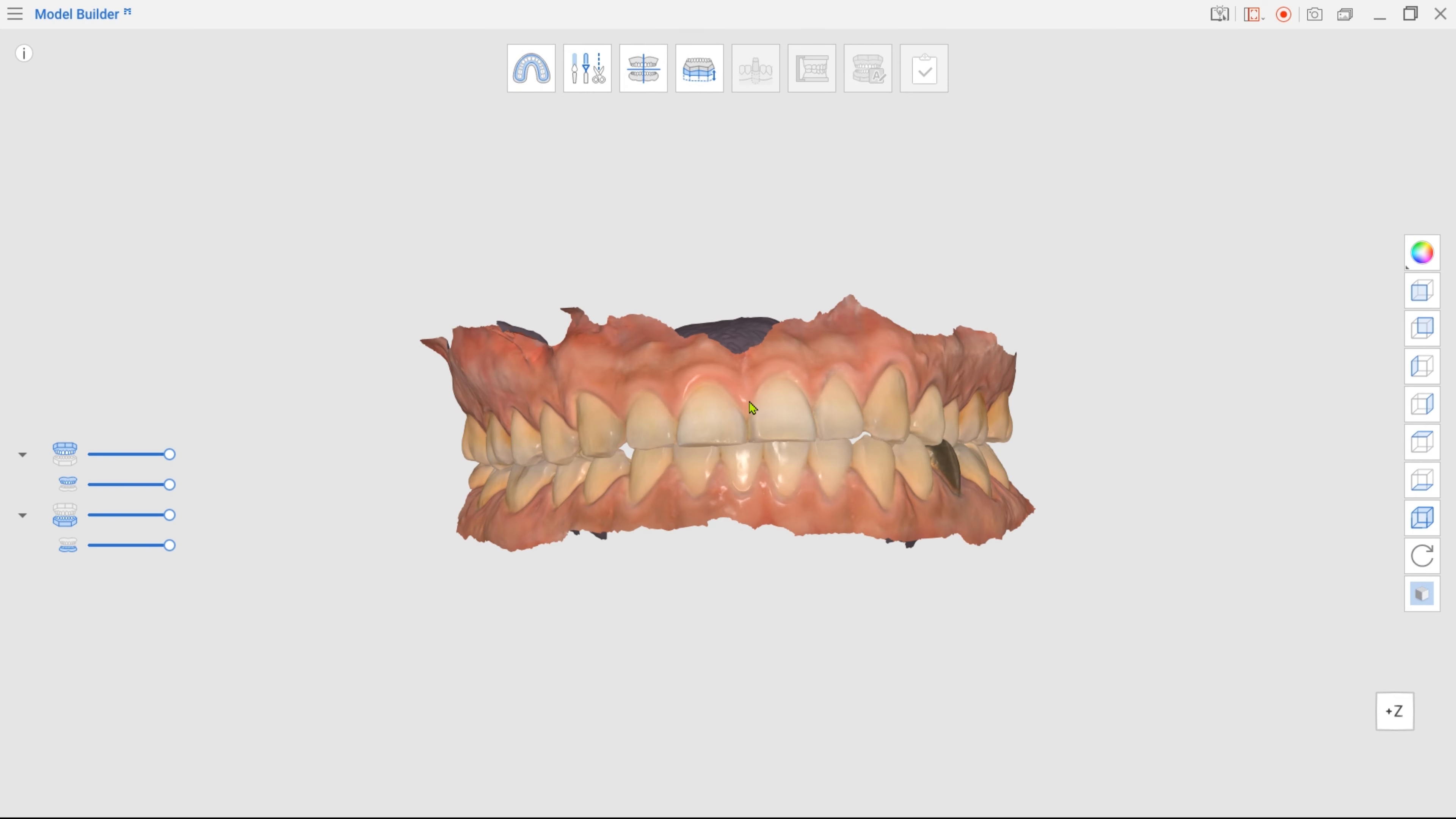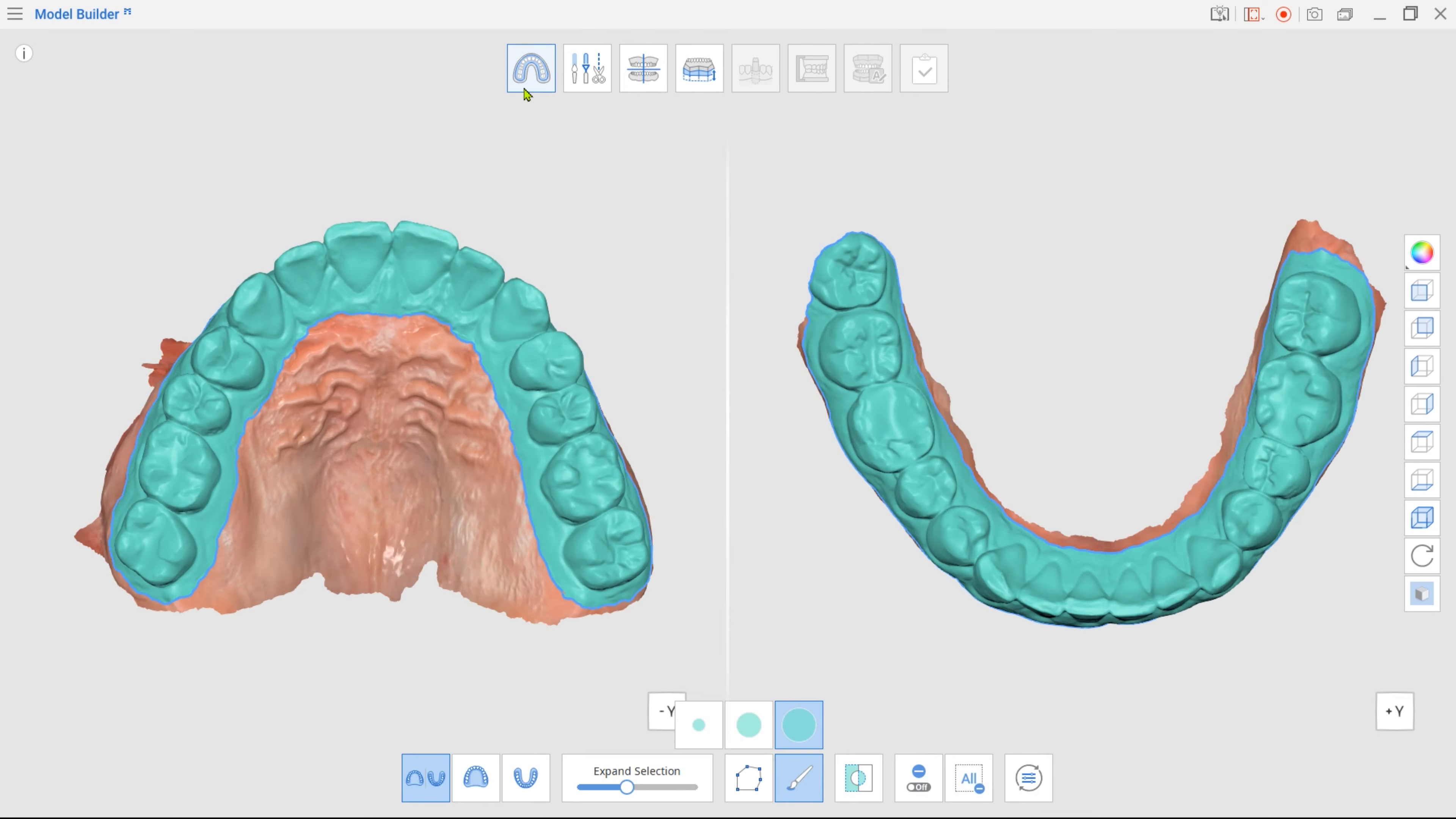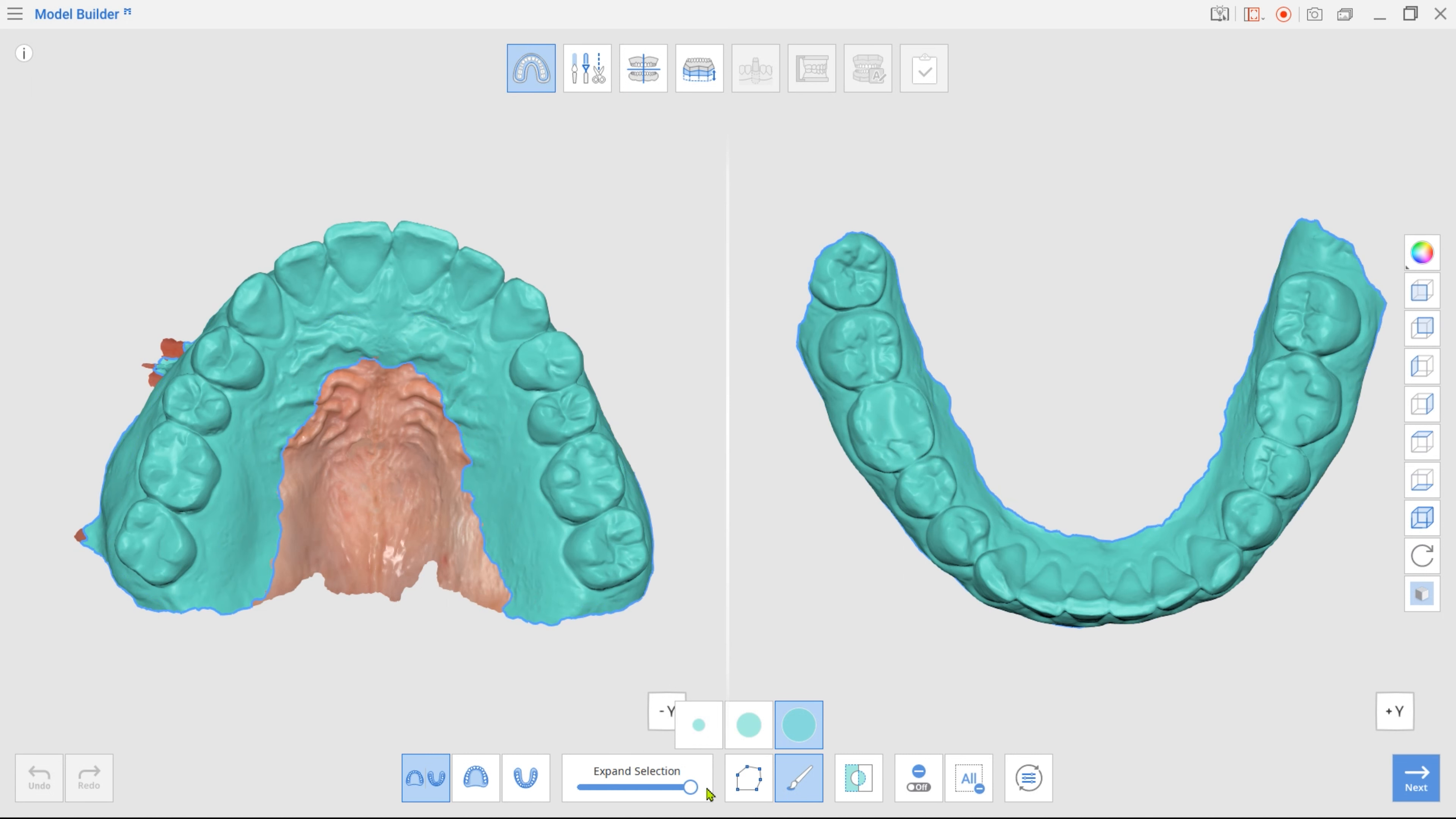Enter Area Designation mode. Enlarge selected areas using the Expand Selection slider. Left out parts can be selected with brush selection.